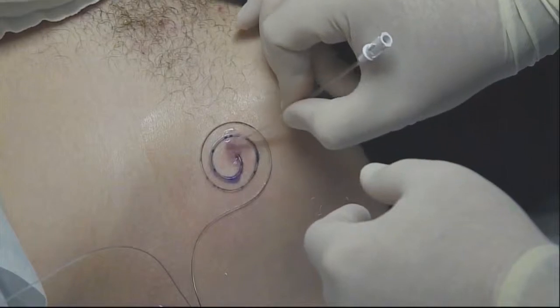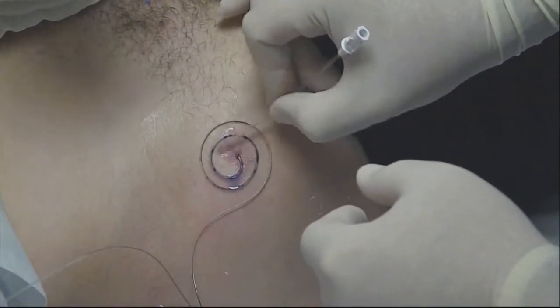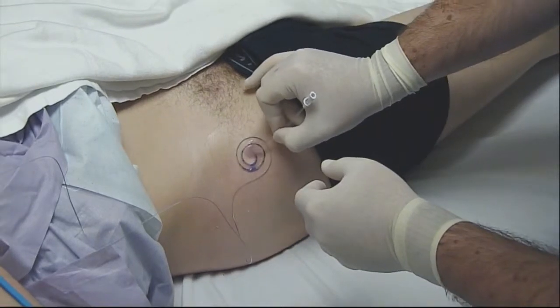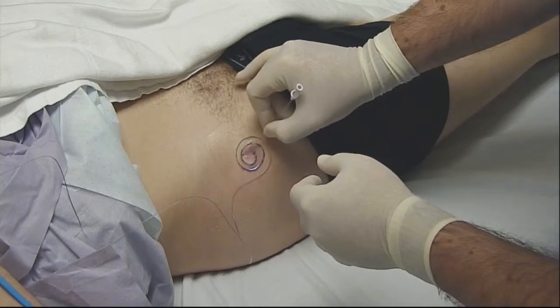Noelle is free-dropping that Histoacryl so that we can use this on multiple patients without cross-contamination. Just three or four drops — usually we'll do one more just to make sure we get good coverage. I use the filter needle that comes in the epidural kit as a magic spreading wand to evenly apply all this and get a nice seal.